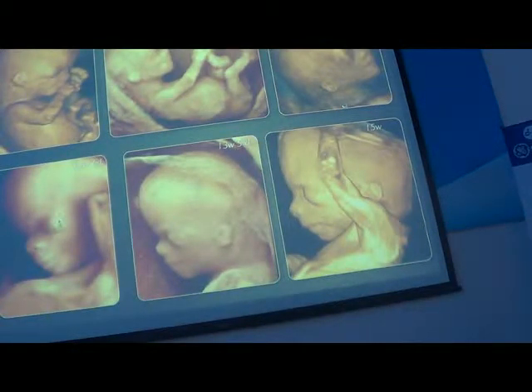And exophthalmia is normal in the first trimester of the pregnancy and also in the first part of the second trimester. You can see the eyes bulge slightly.